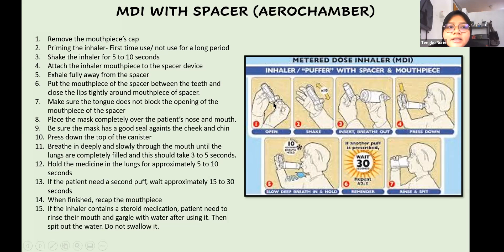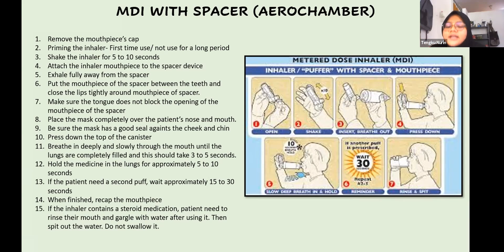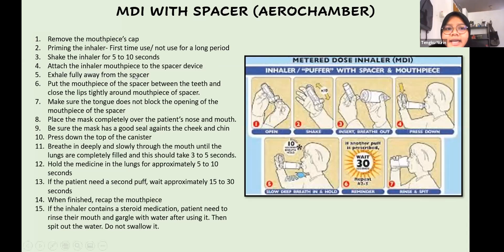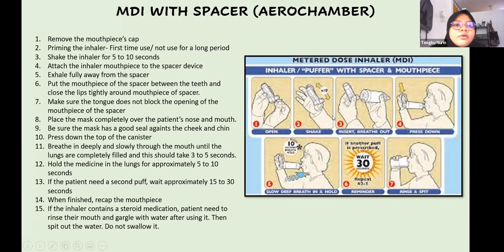If the patient is using the inhaler for the first time or has not used it for a long period, prime the inhaler by shaking it and spraying it into the air a total of four times. If priming is not needed, shake the inhaler for 5 to 10 seconds. Attach the inhaler's mouthpiece to the spacer device — there is a hole at the back of the spacer; insert the mouthpiece of the inhaler into that hole.